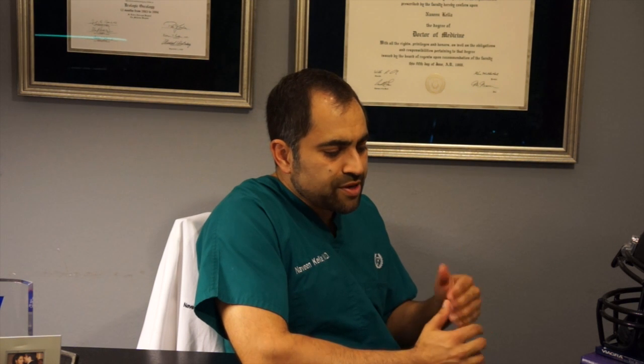With the Rezum, we typically will send you home with a catheter or teach you how to catheterize yourself for a few days. There's some swelling that can occur after the procedure, and for about 4 weeks the swelling can cause some increased frequency, perhaps some urgency, and waking up more at night. We'll keep you on your medications if that's what you were taking originally, and we'll give you some other medications to try to relieve these symptoms. But then after about 4 weeks, patients feel much better typically with their urinary symptoms.